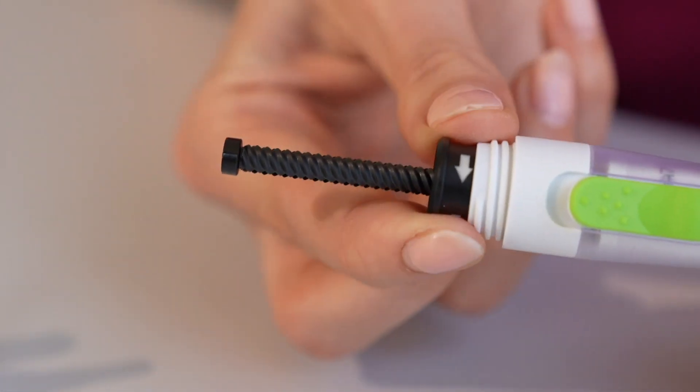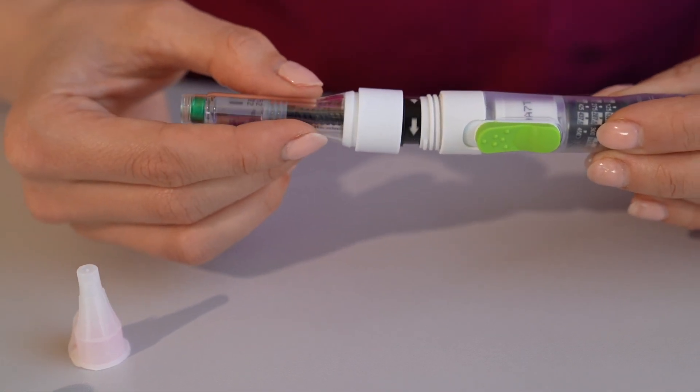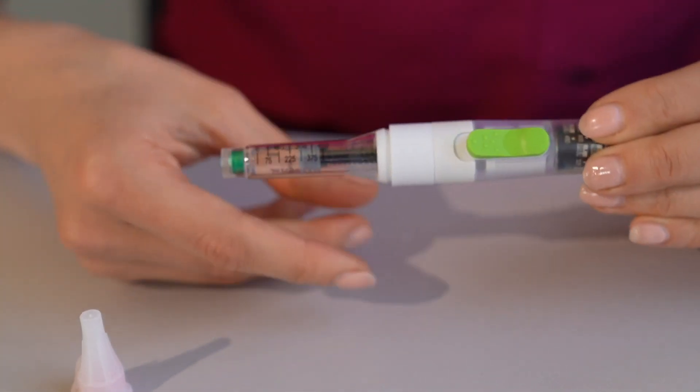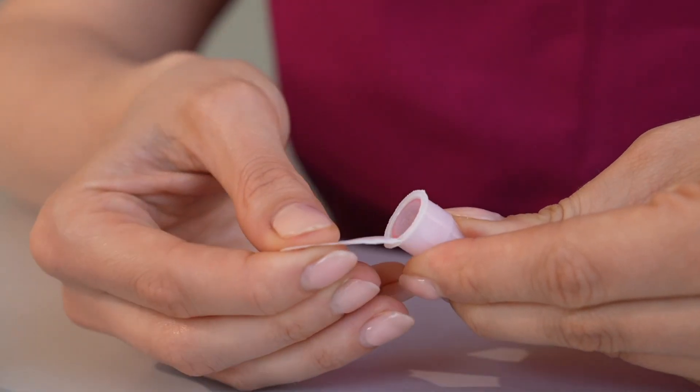You will notice the plunger is fully extended. Insert the plunger into the end of the cartridge, slowly push together and screw to form a tight seal. Take the needle, remove the seal and screw onto the applicator.